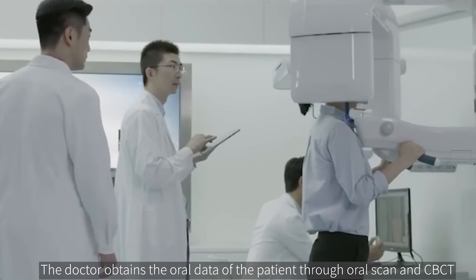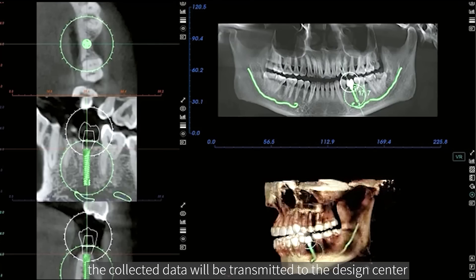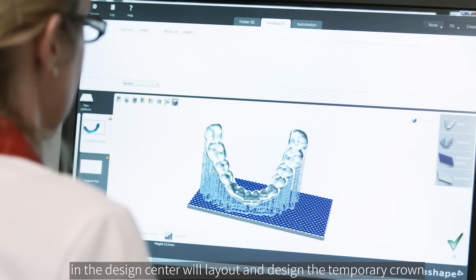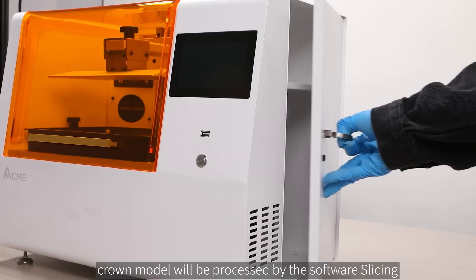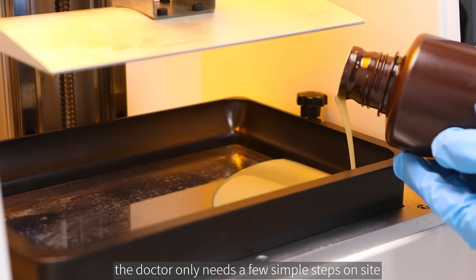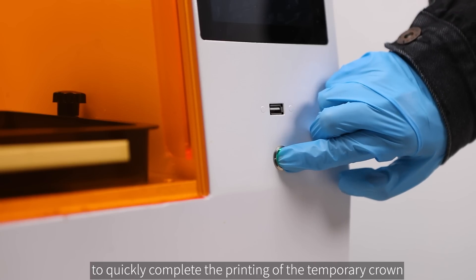The doctor obtains the oral data of the patient through oral scan and CBCT. The collected data will be transmitted to the design center, and professional dental designers will lay out and design the temporary crown. After the design is completed, the three-dimensional crown model will be processed by software slicing, and then printed using the Akeme R3PRO. The doctor only needs a few simple steps on site to quickly complete the printing of the temporary crown.